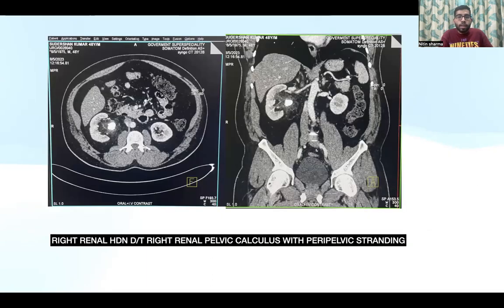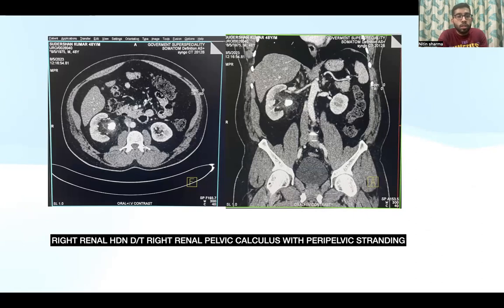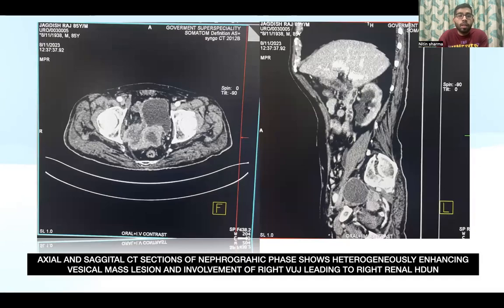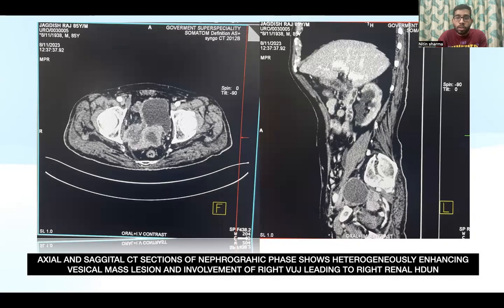This is our first case. As you can see, the axial and coronal CT sections show right renal hydronephrosis due to a right renal pelvic calculus with peripelvic stranding. This is another case showing axial and sagittal CT sections demonstrating a heterogeneously enhancing vesical mass lesion with an extravesical component and concomitant involvement of the right VUJ causing right renal hydronephrosis.